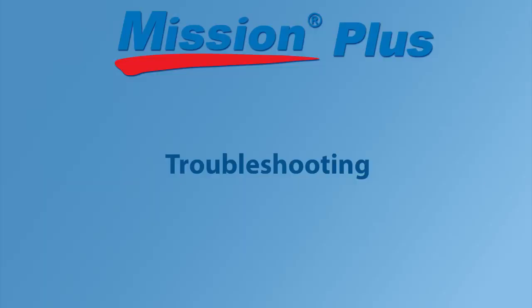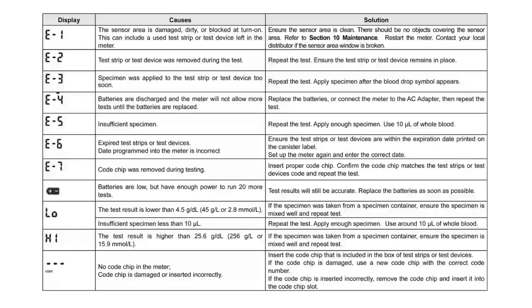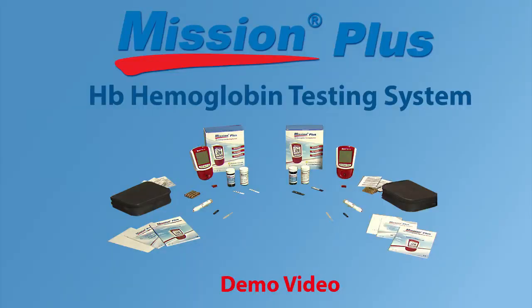Troubleshooting. This table displays some of the errors you might encounter and the actions you will need to take in order to solve the problem. Please refer to the user's manual for more detailed instructions. The Mission Plus HB hemoglobin testing system offers accurate and precise results at your convenience. Please refer to the manual for detailed instructions.